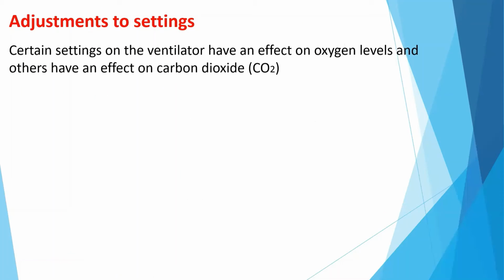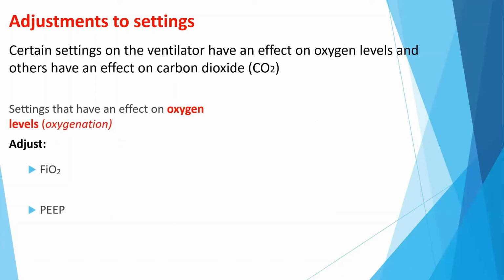Certain settings on the ventilator have an effect on oxygen levels, and others have an effect on carbon dioxide levels. Settings that affect oxygen, which is called oxygenation, are the FiO2 settings and the PEEP settings. If I were to increase either one, the oxygen level would rise.